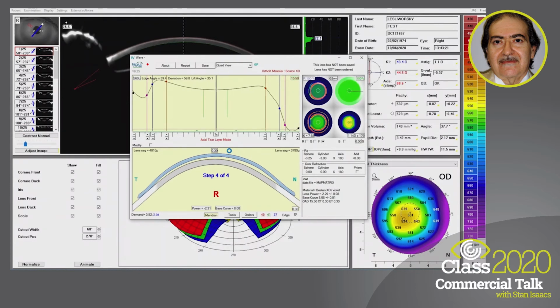So instead of being in free form, we will put it in a geometric axis once this fourth meridian has been actually calculated. And this is where my staff fell asleep and didn't press the G quickly enough. Okay, here we go.